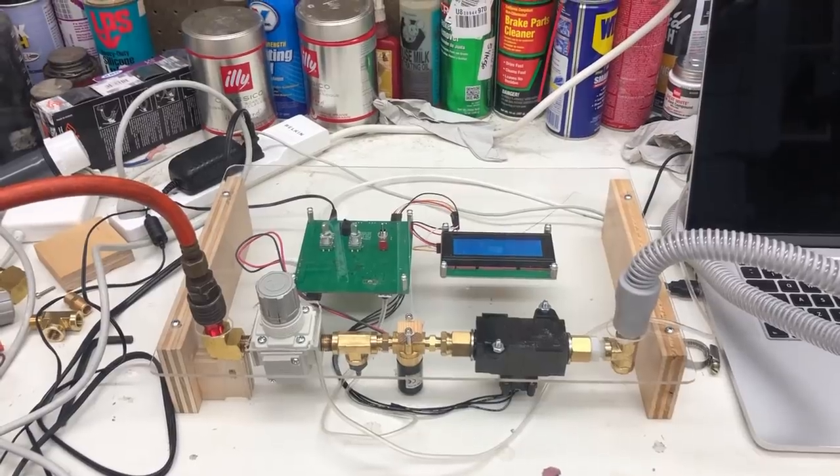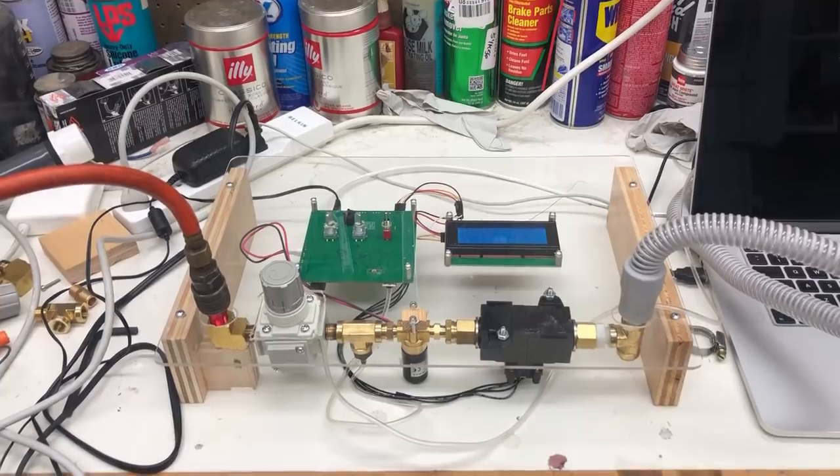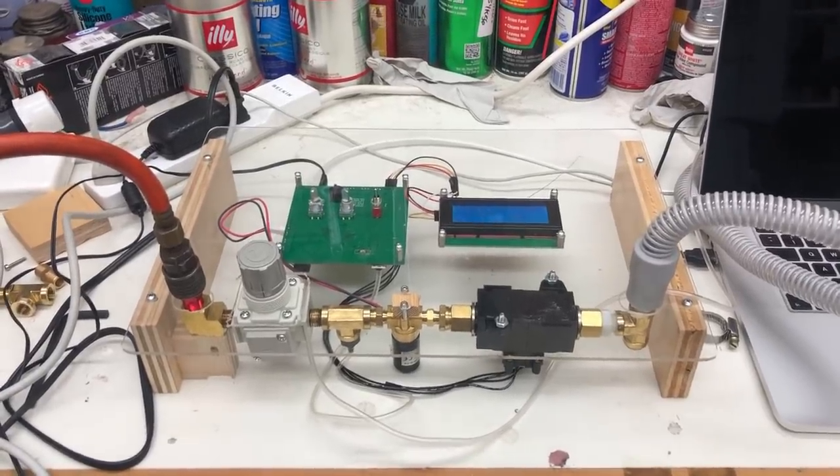Our philosophy is to build the simplest possible ventilator that could be produced rapidly and inexpensively, but meets the needs of treating patients with COVID-19.